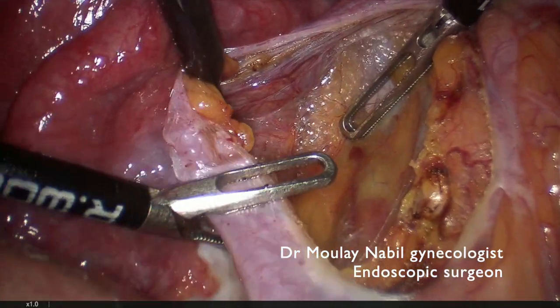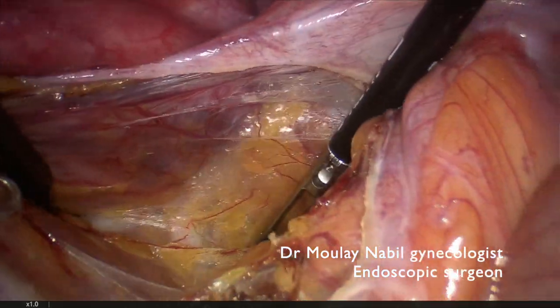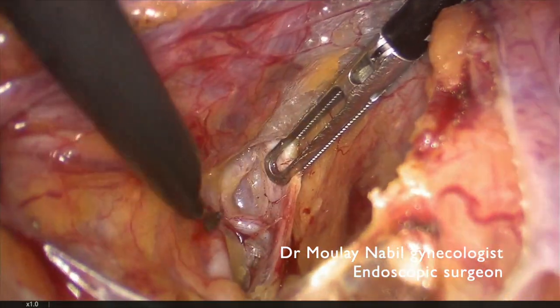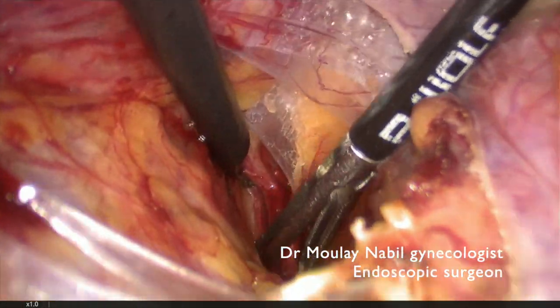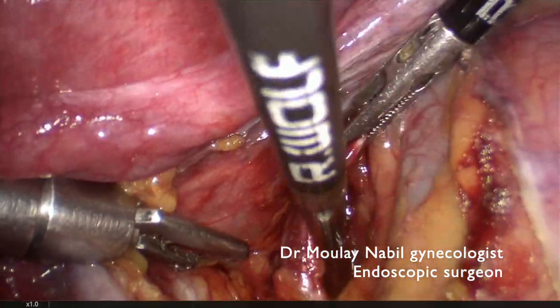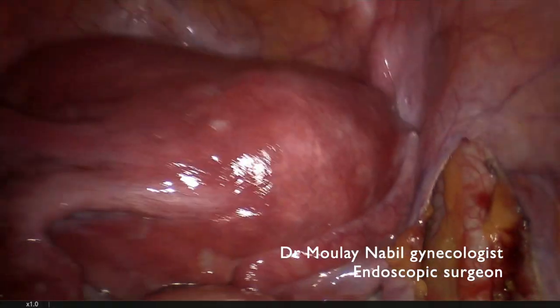We reach the ureter easily and by movement of traction and countertraction we develop the space lateral to the ureter, which is the lateral pararectal fossa or Latzko space. We can now pull laterally the vessel and we can see both the uterine and umbilical arteries. We decide to put our clip just below these two arteries. It is important during this step to lateralize — or rather medialize — the ureter. Our vascular control is now done.